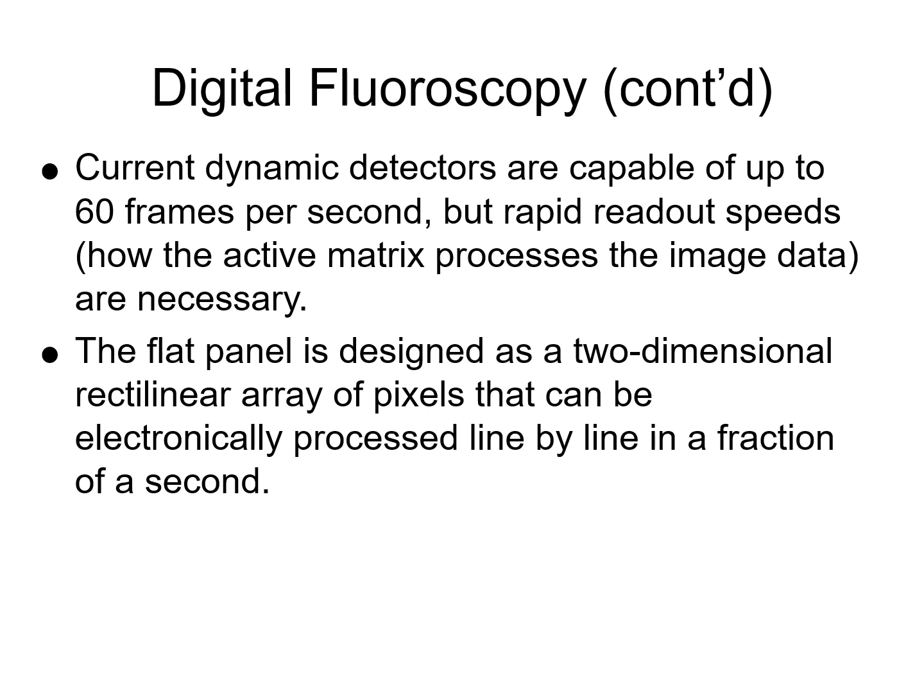It does computations at a clock speed of 5 gigahertz. And so even if we have 1 million pixels in our pixel matrix, it can do that 5,000 times. If it's just reading out the value, it can do that 5,000 times a second. So in other words, it processes really fast.